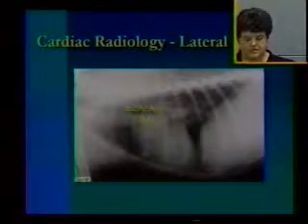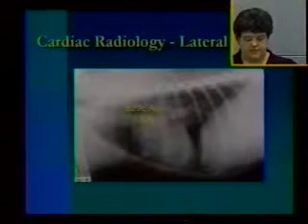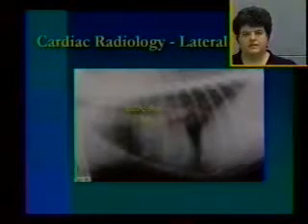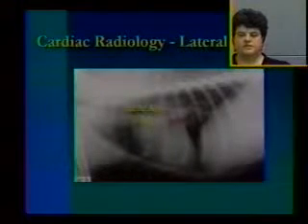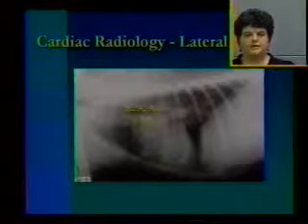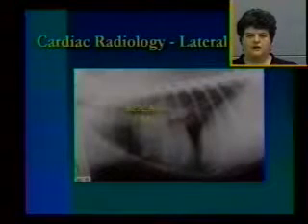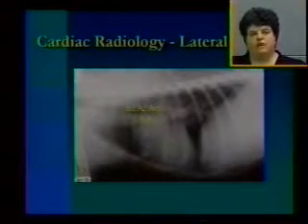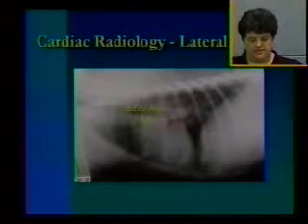Like I said, we'll start with heart. That's where I start. This is a lateral projection of the thorax, and I've just outlined for you the places that the different parts of the heart are located. The left atrium is seen at the dorsal aspect of the cardiac silhouette. You can see it outlined there. When it becomes enlarged, it causes dorsal deviation of the trachea towards the spine. The angle becomes more parallel. If you have enlargement of the left ventricle, just ventral to that, that's a more difficult call, but sometimes you can identify straightening of the caudal cardiac silhouette. Enlargement of the right ventricle is going to cause increased sternal contact, or more of the heart will be in contact with the sternum.